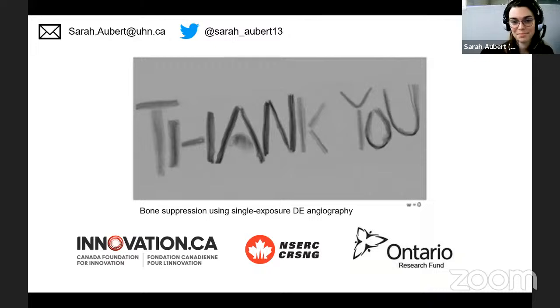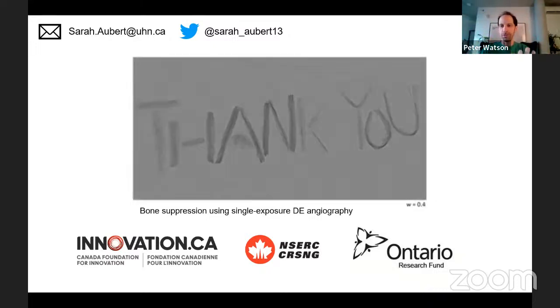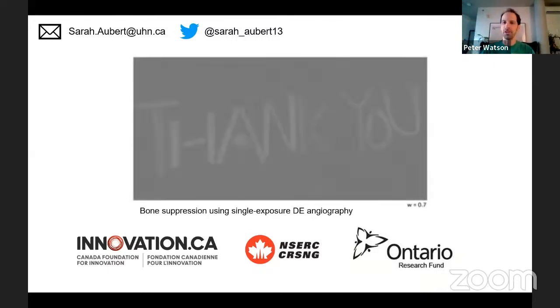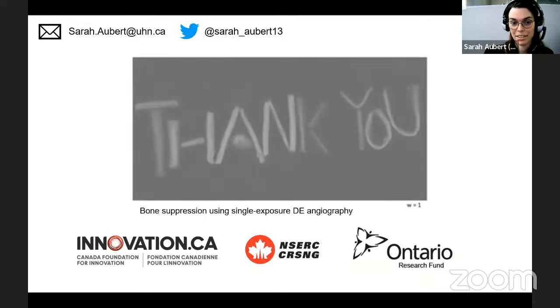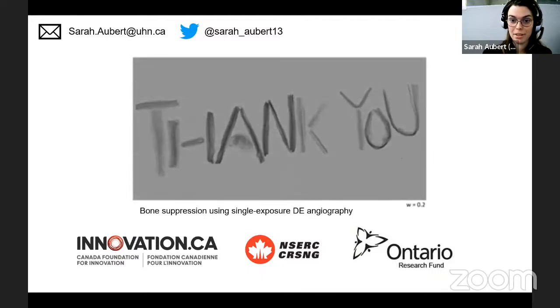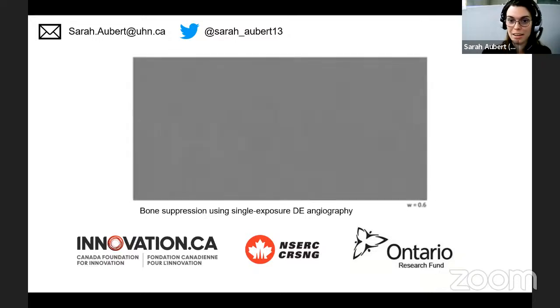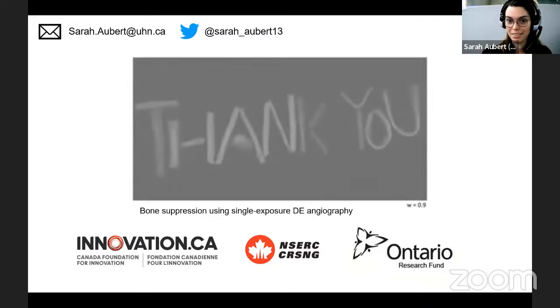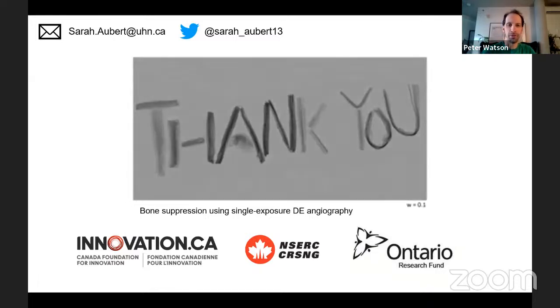You could maybe use that information: whenever I have a boundary of a structure between background and object, keep that. And if I just have high frequency that's more uniform or amorphous, that's noise. Mm-hmm. And the way that we're subtracting them, it's the same single image set that they're being subtracted from. So what ends up happening is it's subtracting the correlated noise, but where those lines come in, it's consistent among each of the data sets. And so it knows that that's an edge rather than noise. Right, that's true. That's a good point. Okay, cool, thank you.